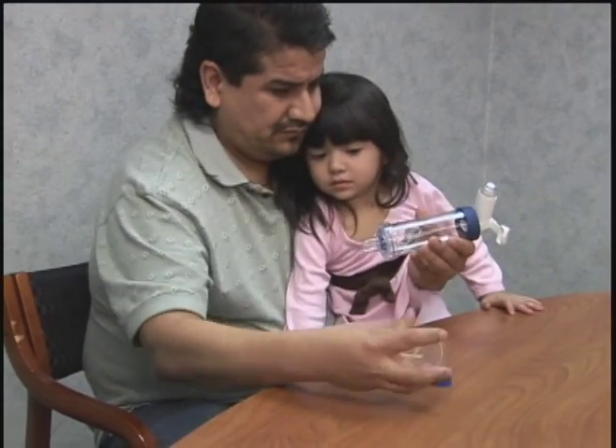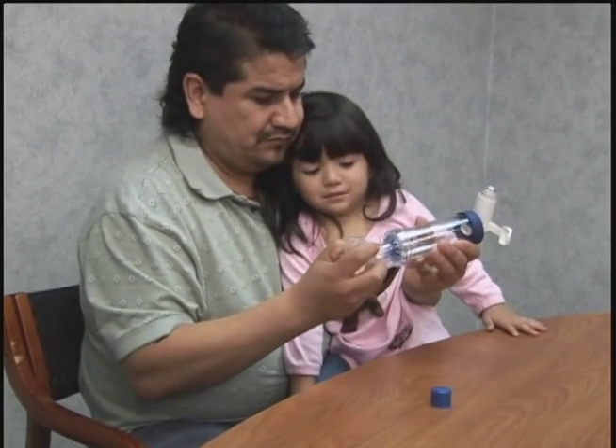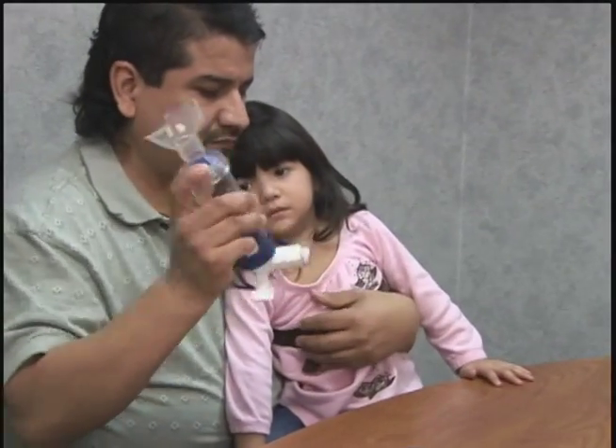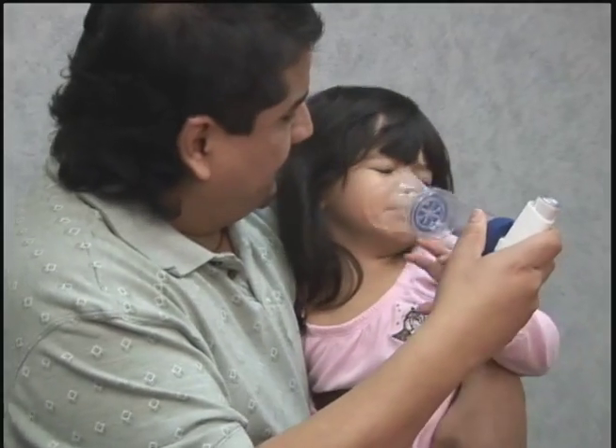Select the mask size that fits over the child's nose and mouth. Attach the mask to the mouthpiece end of the holding chamber. Shake the inhaler for at least 10 seconds. Place the mask gently over the nose and mouth.